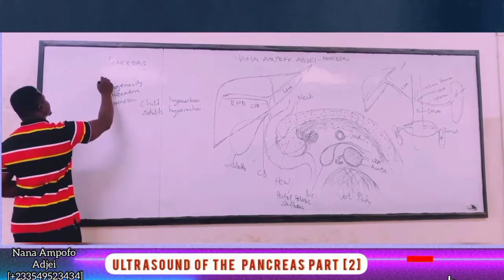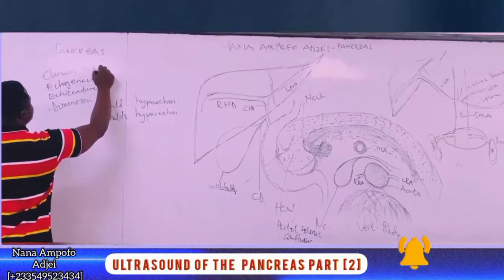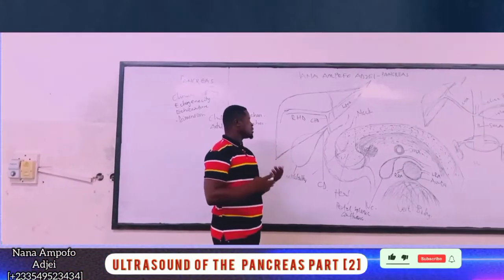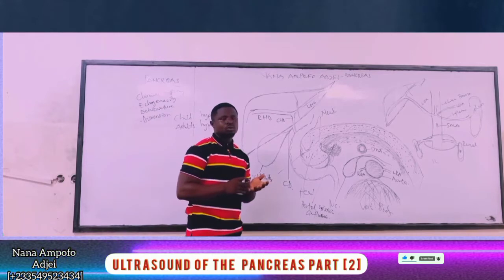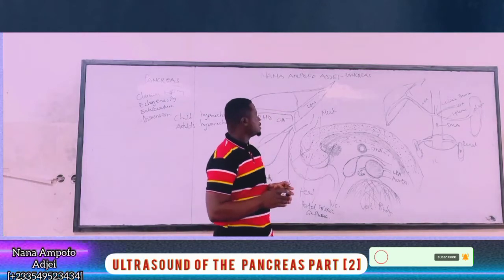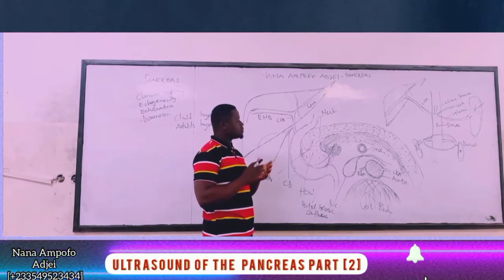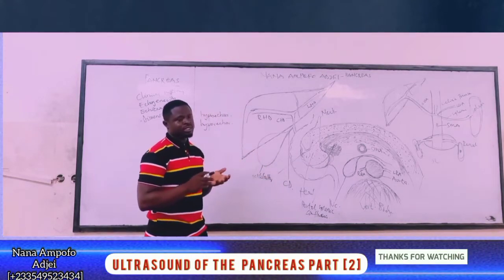But first, the clinical history. The clinical history is very important. Okay. So what is the size of the pancreas? Because dimensions are very important in sonography. Why is it so? Because you may identify a pathology against the normal sonographic pattern, and it becomes suspicious whether this pancreas is enlarged or not. So always we have ranges for those measurements.